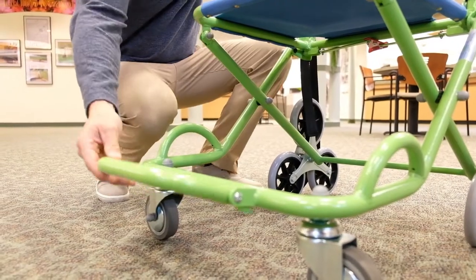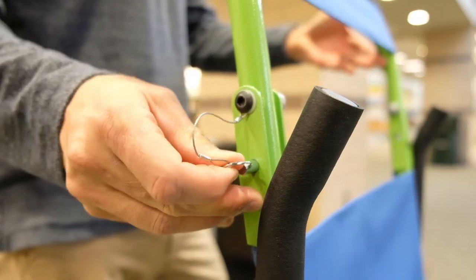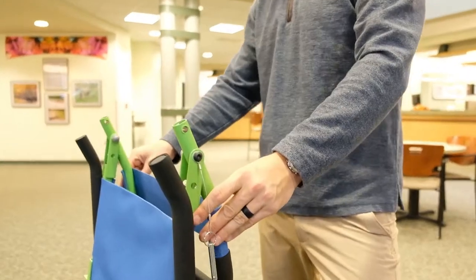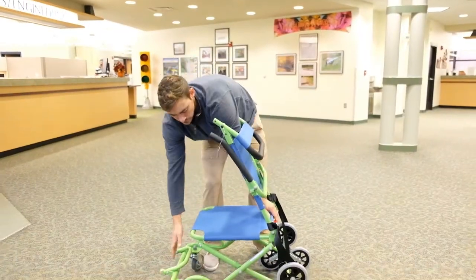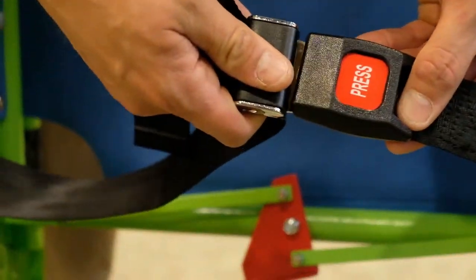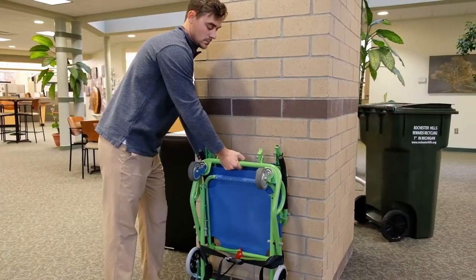To return the chair to storage, begin by folding the footrest and arms back into the closed position. Next, remove the safety pins on each side of the handle and fold the handle down. Lower the chair to the ground into a folded position and then fasten the safety belt around the folded chair to secure it. Return the chair to its storage position, ready for its next use.